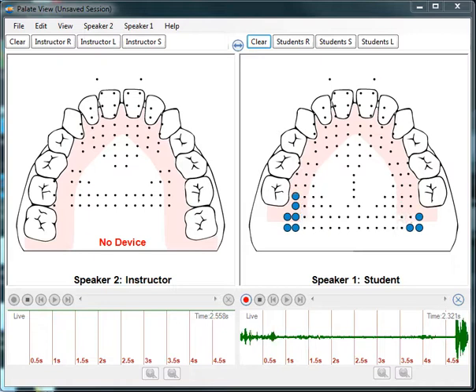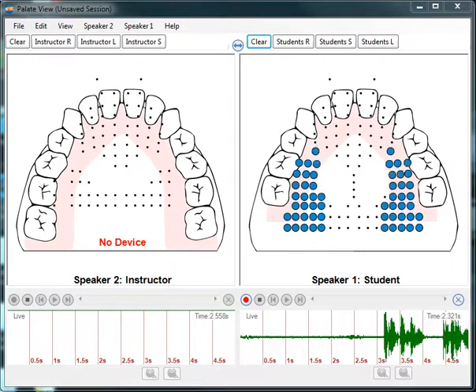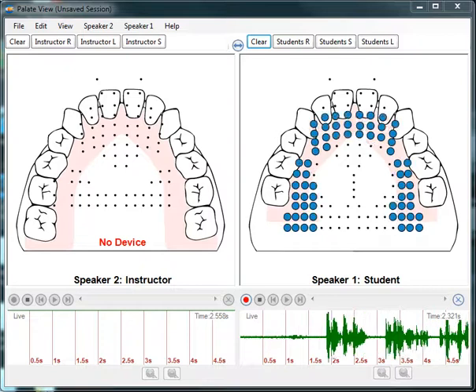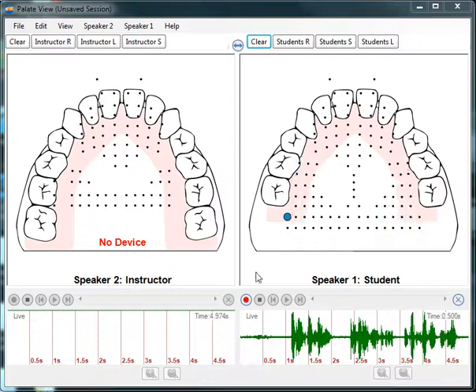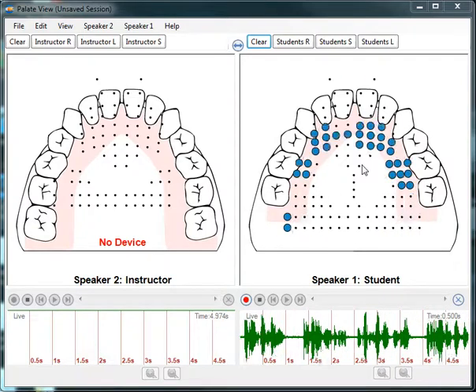After installing PaletteView software, plug your data link into the computer and pop your smart palette into your mouth. You can see my tongue-to-palette contact on your computer screen.